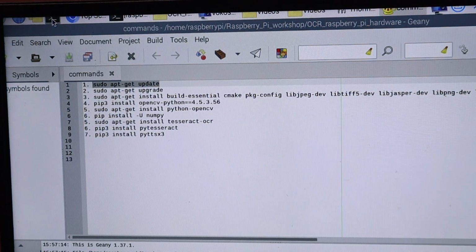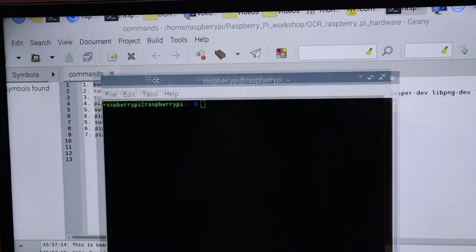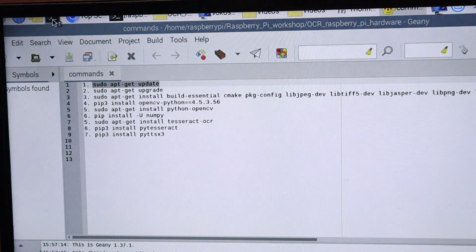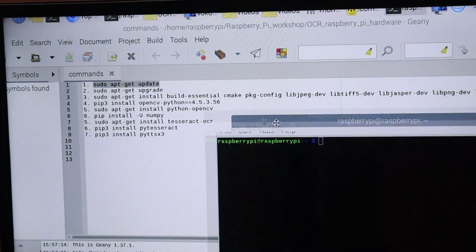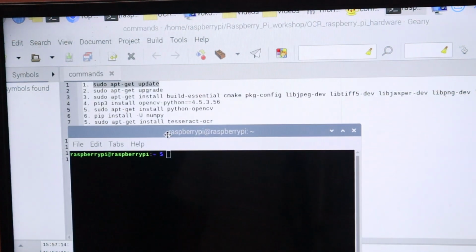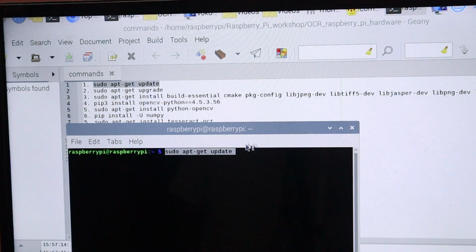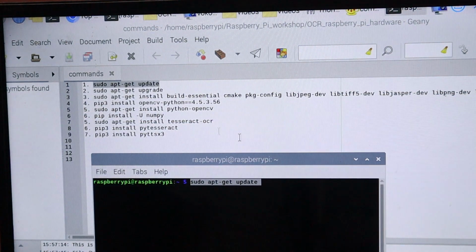You can see the black terminal, which should start with Raspberry Pi. So this is my black terminal, and it will open from here. One by one you run the commands: first command, second command. Right click, paste, and press enter. I already did that one, so I will not repeat the same process again. In this way you can run the commands one by one.